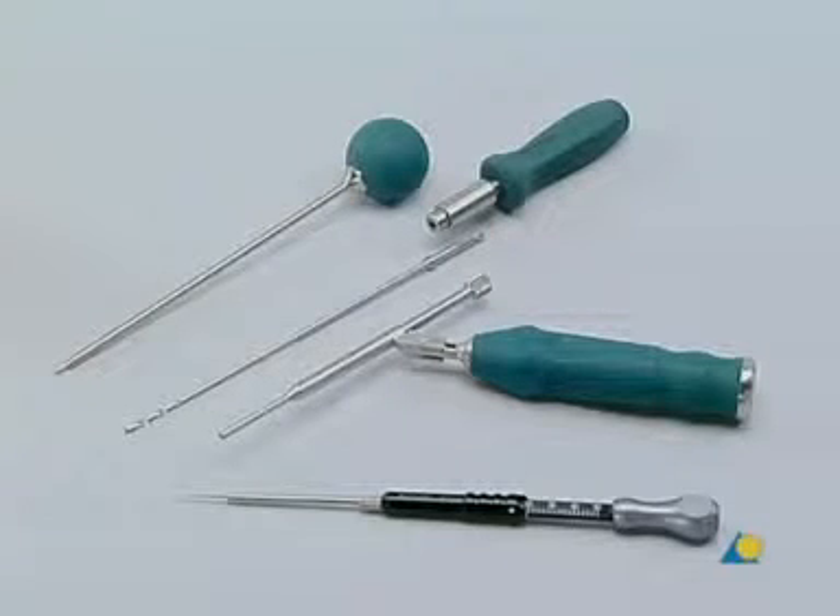These are the instruments used to prepare the hole for the most cranial screw. Left to right: the awl, the 2.4 millimeter drill bit with stop, the handle with quick coupling, the drill sleeve with scale, and the depth gauge. Instead of the handle with quick coupling, a power tool can be used.